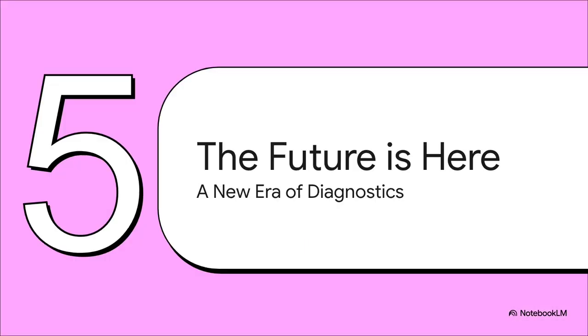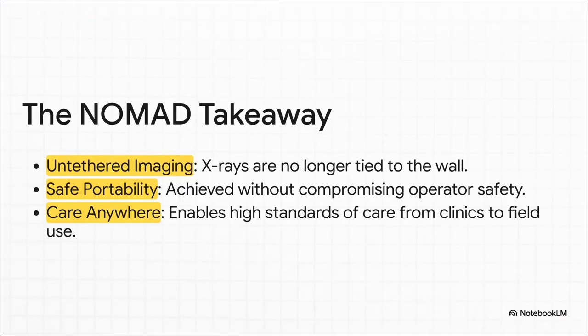So when you combine this level of portability with this image quality and this proven safety, it becomes pretty clear this isn't just an improvement on an old idea. We're really looking at a whole new era for diagnostics. So what's the bottom line here? What does this all mean?